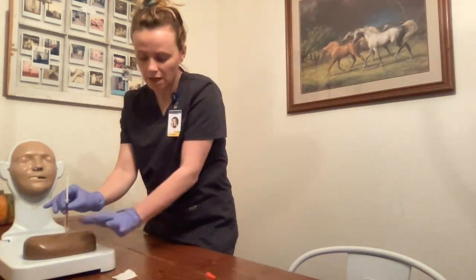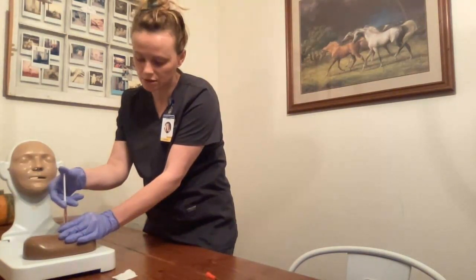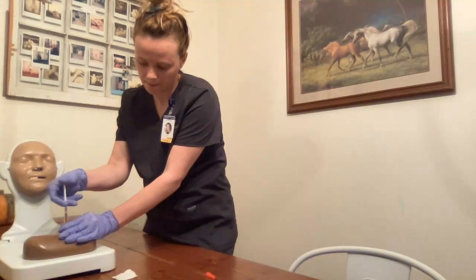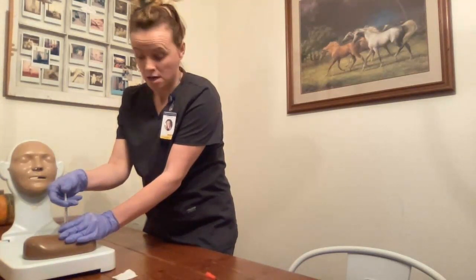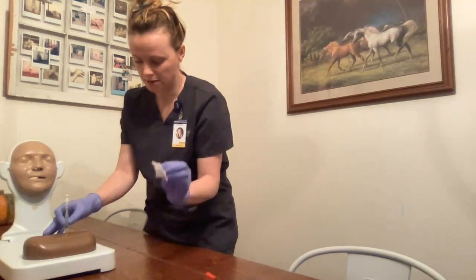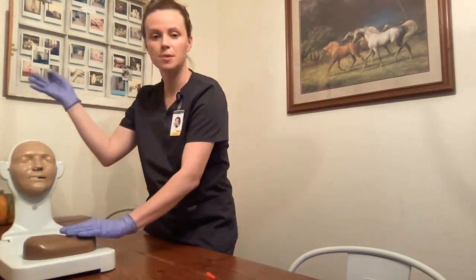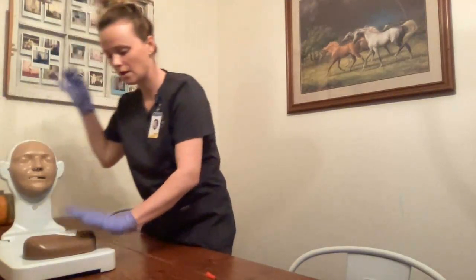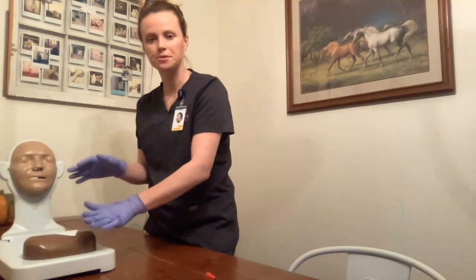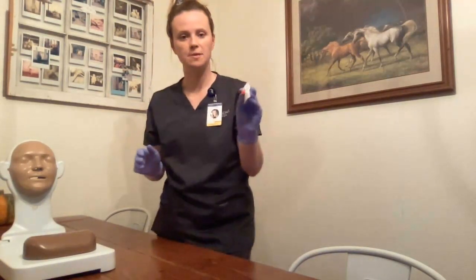I will quickly and firmly inject the needle into the skin at a 45 to 90 degree angle, just like a dart, palm down. There we go. I release the skin fold, grasp the lower end of the syringe with my non-dominant hand, then come up with my dominant hand and slowly inject the medication into my patient's abdomen. Then, holding with my dominant hand, I grab my gauze pad, remove the needle, gently place the gauze pad on top, and immediately dispose of my needle into the sharps container. When I put the gauze pad on top, I do not want to rub or massage — I place it on top to make sure there's no bleeding. There's no bleeding, so no need for a band-aid.